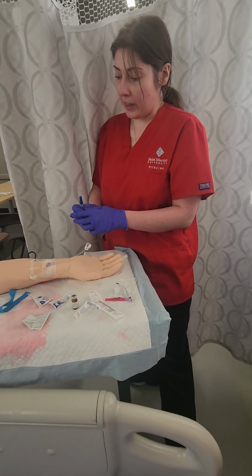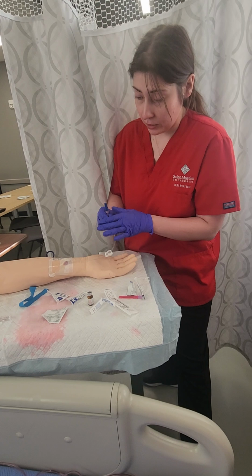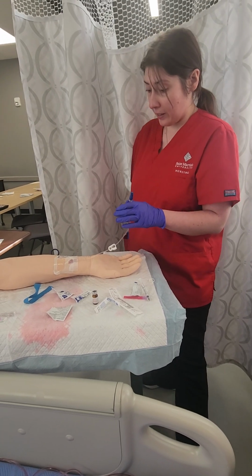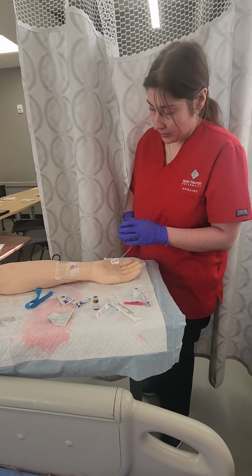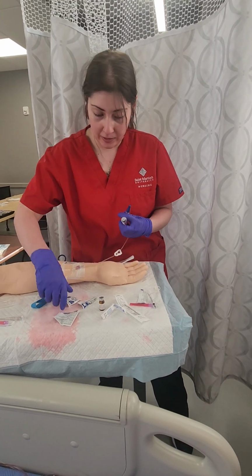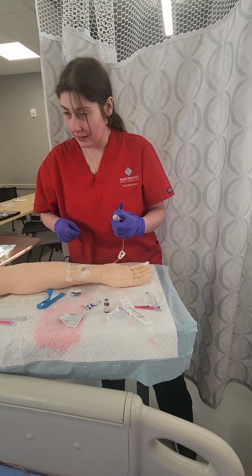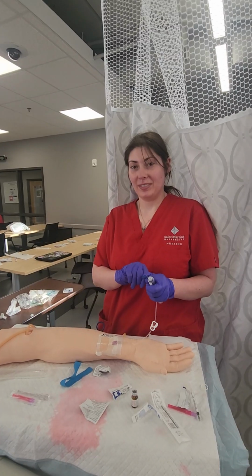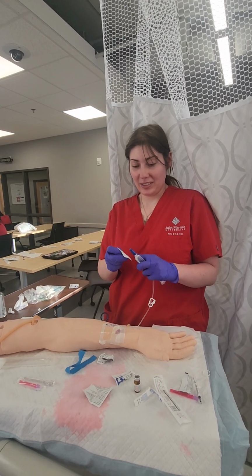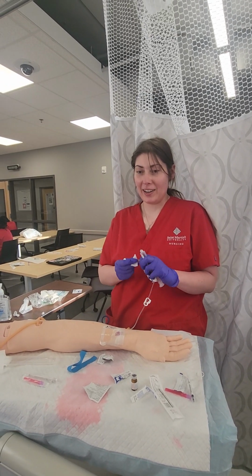Okay, and my gloves were clean when I inserted my IV, so I didn't change them at that point. Can you pause it? Okay, so I asked for help to go get my alcohol wipe.